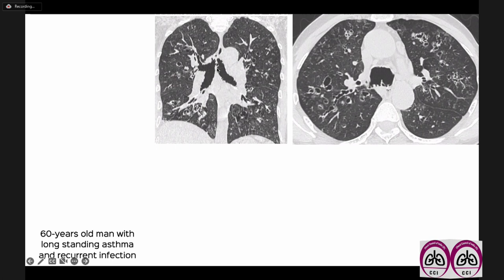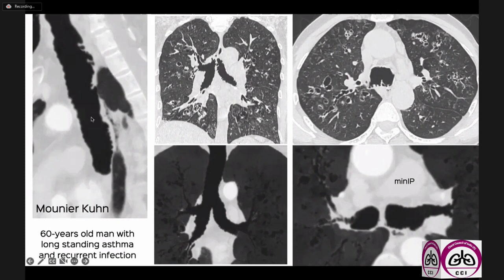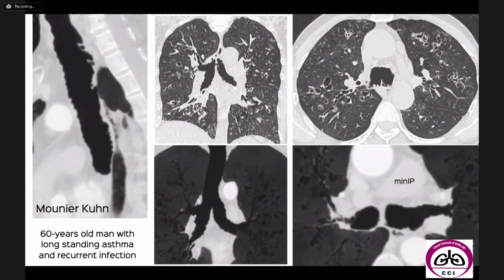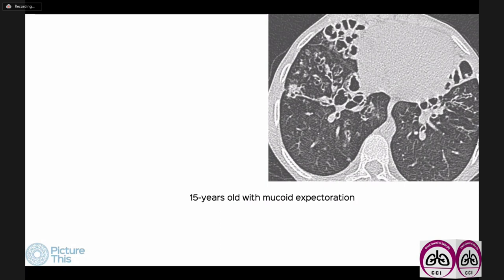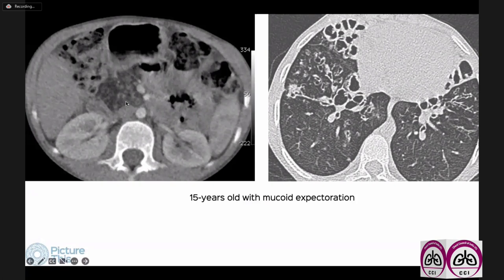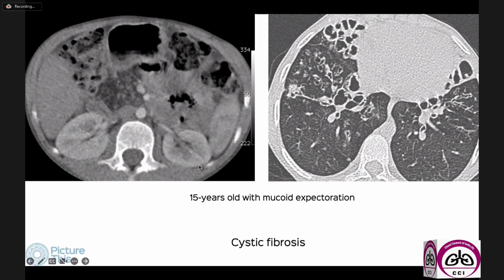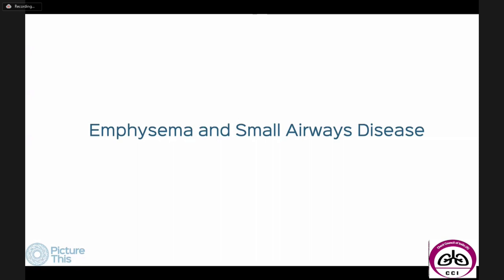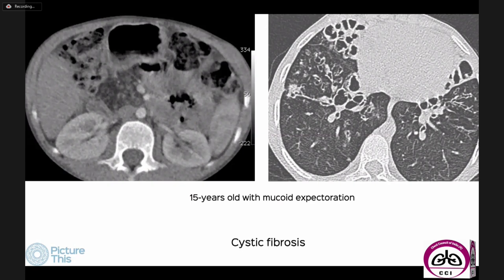Another etiology — a 60-year-old man with long-standing asthma and recurrent infections shows bronchiectasis along with striking diverticulae in the trachea and main bronchi on minimum intensity projection images. This is very typical of Mounier-Kuhn syndrome, which normally occurs in younger individuals but may be picked up later if undiagnosed. We also have a 15-year-old with bronchiectasis where the pancreas shows atrophy and fat infiltration — this combination is highly suggestive of cystic fibrosis.